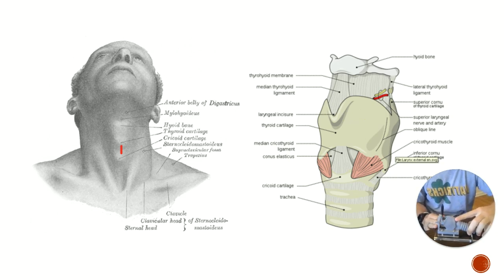If the casualty is obese or has a thick neck, what you could do is put your finger in the suprasternal notch right here, place 4 fingers here, your pinky here, and then where your index finger is, that's relatively close. I guess I have like a giraffe neck. Mine's a little bit too short, but right there is where I'd go for me. So this hand-of-God move with the 4 fingers on the suprasternal notch could be a way to let you know if the person has a really fat neck.